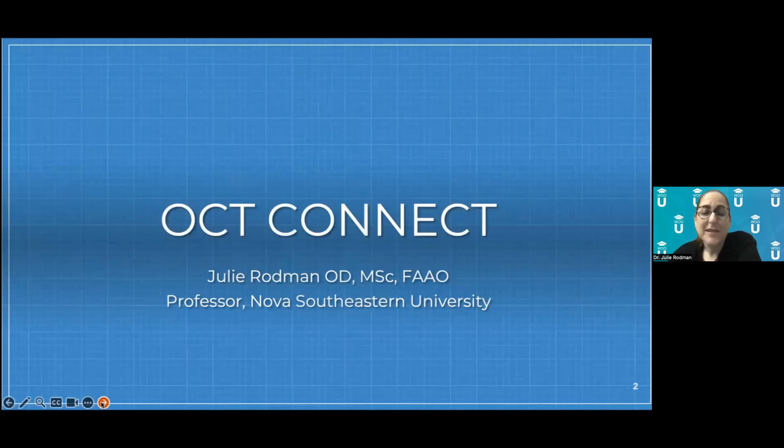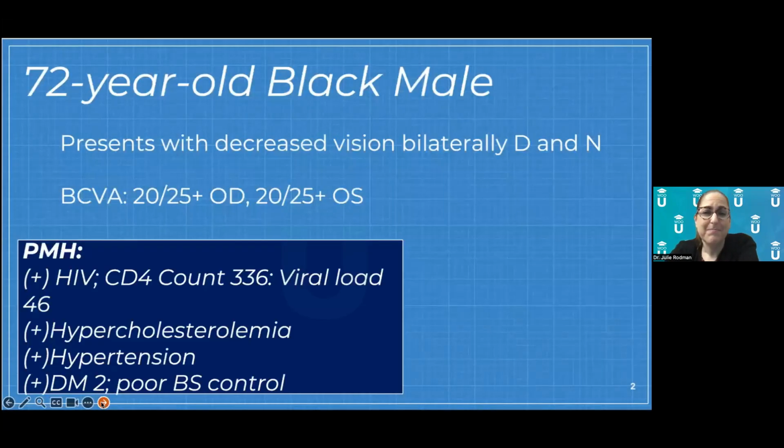So when I put together this lecture, what I wanted to do was really think about cases where we rely a lot on OCT to make the diagnosis. We're not going to get through all of this tonight, but we'll go through some really fun cases where, like I said, OCT really was the game changer in helping to make the diagnosis. So let's start off with this 72-year-old Black male.